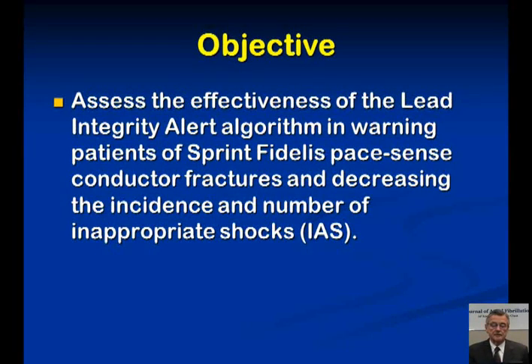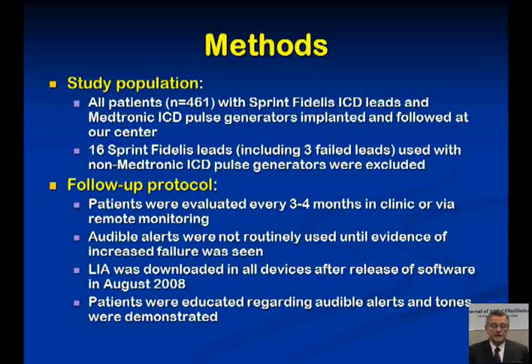The objective of our study was to assess the effectiveness of the lead integrity alert algorithm in warning patients of Sprint Fidelis pace sense conductor fractures and for decreasing the incidence and number of inappropriate shocks. The study population consisted of 461 patients with Sprint Fidelis ICD leads and Medtronic ICD pulse generators that were implanted and followed at the Minneapolis Heart Institute. 16 Sprint Fidelis leads, including 3 failed leads that were used with non-Medtronic ICD pulse generators, were excluded.